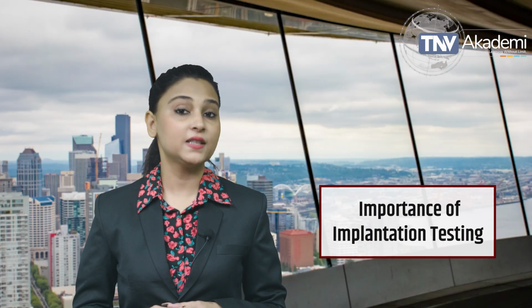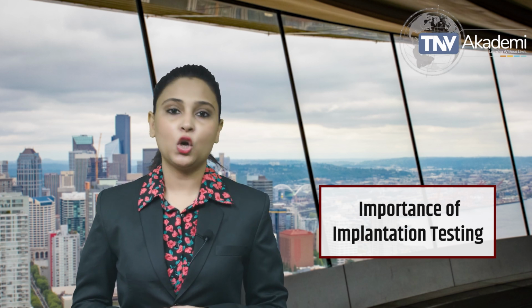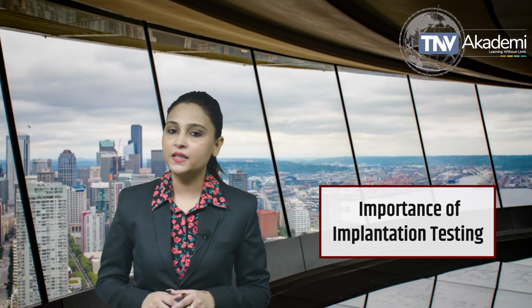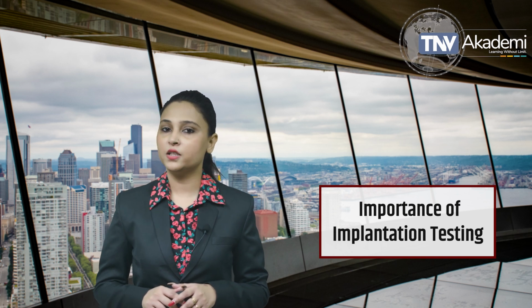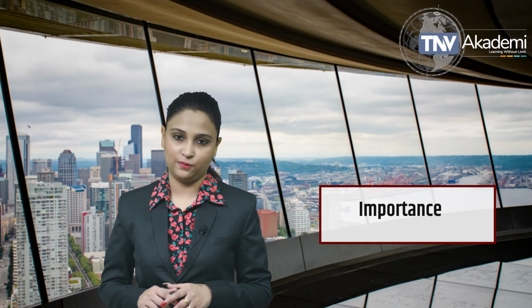Importance of implantation testing. Implantation testing in ISO 10993-6 is critical because it provides a realistic assessment of how the device will behave inside the body. For implants intended to remain in the body for long periods, confirming biocompatibility through implantation testing is essential to ensure patient safety and regulatory compliance.